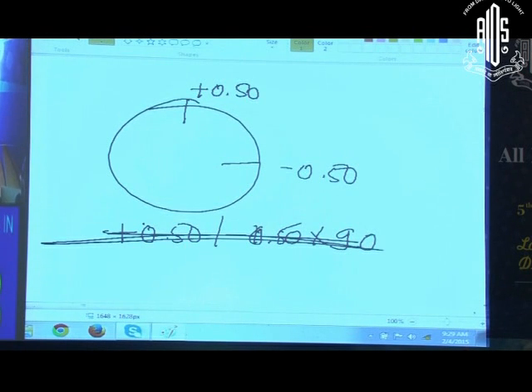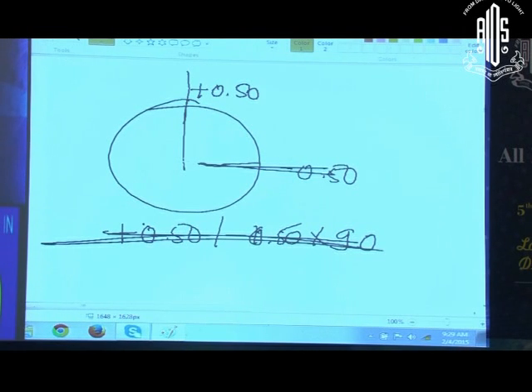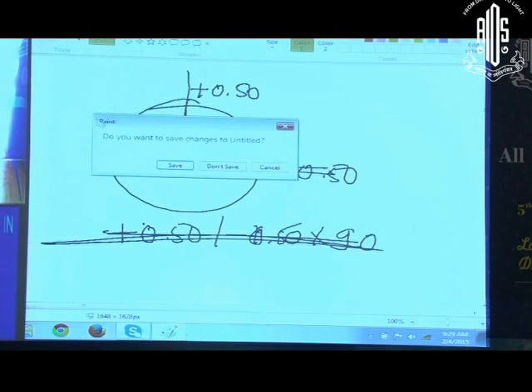So what you do is now, this axis is negative cylinder, this axis is positive cylinder. And the spherical equivalent of a cross cylinder is always 0. So if you put a cross cylinder to any patient, the final visual acuity won't change because you're not going to add any spherical equivalent to this prescription. Now how do we actually use a cross cylinder? There's something that you need to actually do it yourself. I can't really explain everything here, but I'll give you a small tenet. You can go back to your institutions and start trying cross cylinders on some patient so that you will be able to pass the exam. After that, it's up to you to use it or not.